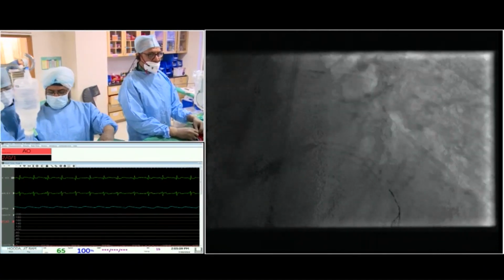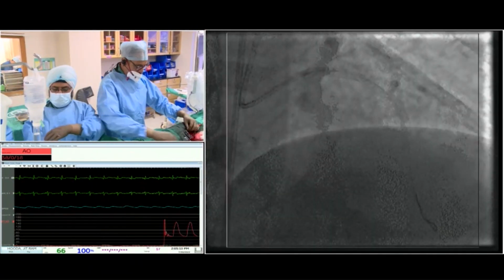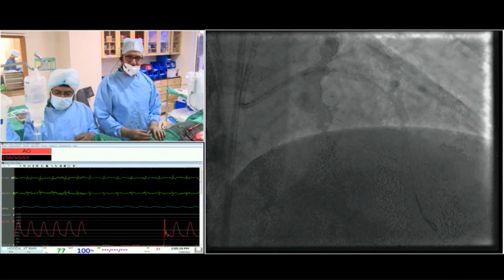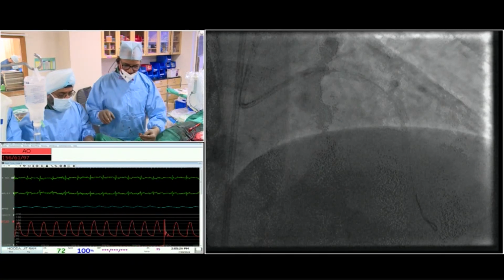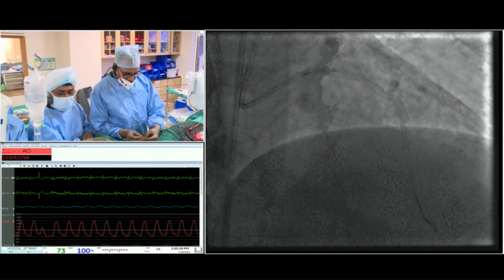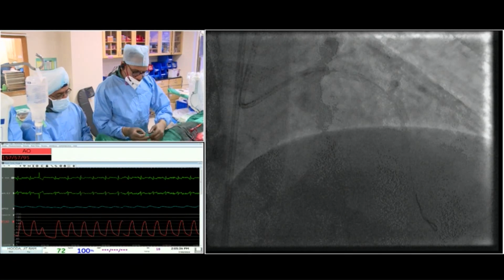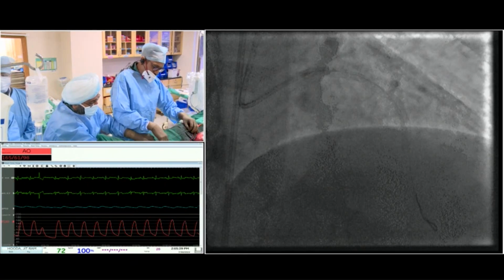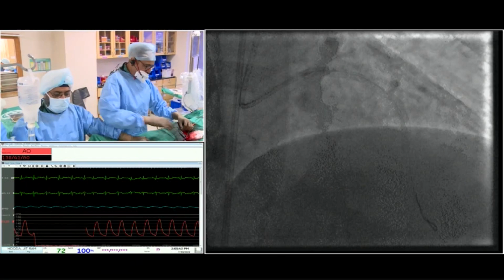We should be doing this carefully with IVUS guidance, so I'll give you a proper IVUS run image now. Dr. Ajit sir, earlier there was damping of pressure here, so what is your strategy when you do crossover? As I said, we'll do it only if it is absolutely essential. I don't open it unless absolutely necessary. You're doing IVUS, sir, now? So this is the final run of IVUS, and then I'm done. You can then move to Mumbai for Ajit Menon's case.